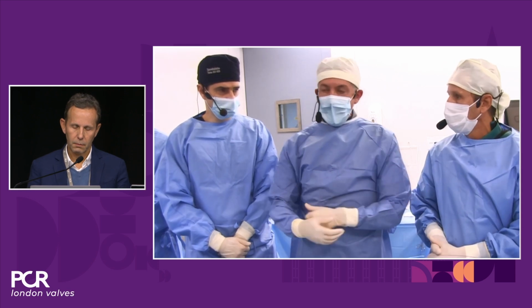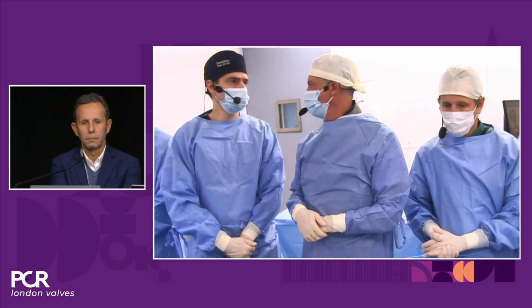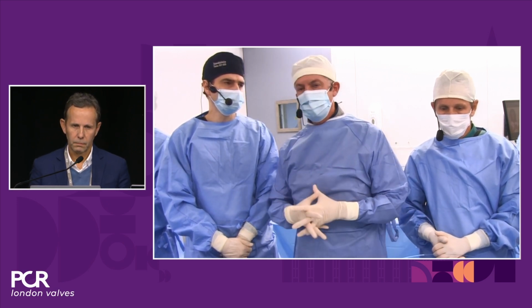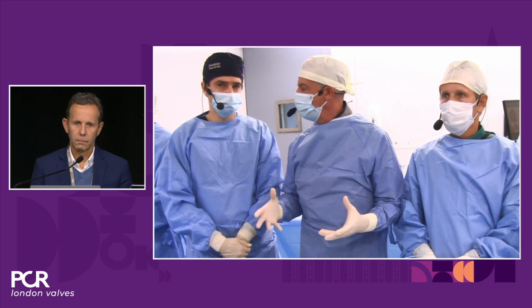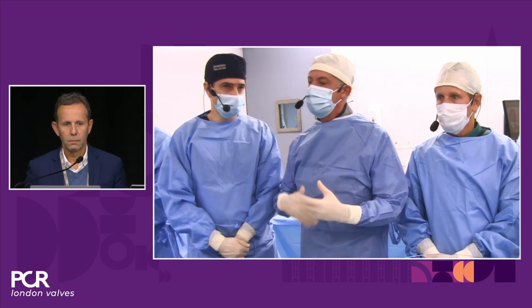Great. And another point for discussion, Henrique, is certainly cerebral protection. I think this is under a lot of debate. Is there a particular rationale for this patient? The calcium score is over 3,000. Is there any particular subset for which you would recommend cerebral protection, or for most of our patients, or do you still wait for more data?